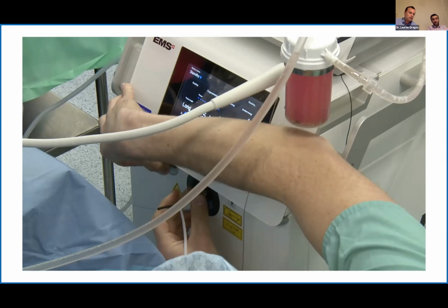And what we would prefer, in order to make things as safe as possible, you see the machine is very close to the working tray, and there's no space between this and the tray and the patient. So it's continuity for the laser fiber and for all the cables that go to the handle. So there's no room for someone to go by mistake in between and to pull the laser fiber, to pull the device out of your hands. And at some point you will have images with us operating, and you see we are close together. Everything is easy to reach, and maybe these details are important as well, right? We tend to think about them.